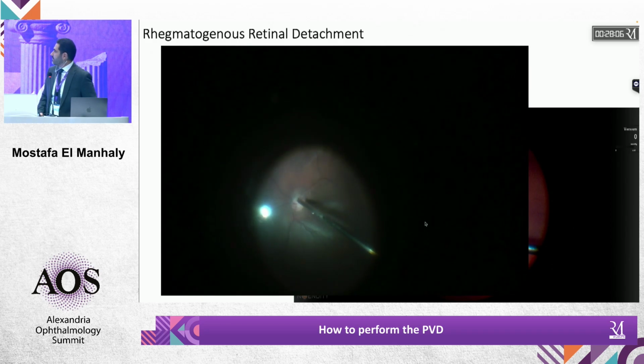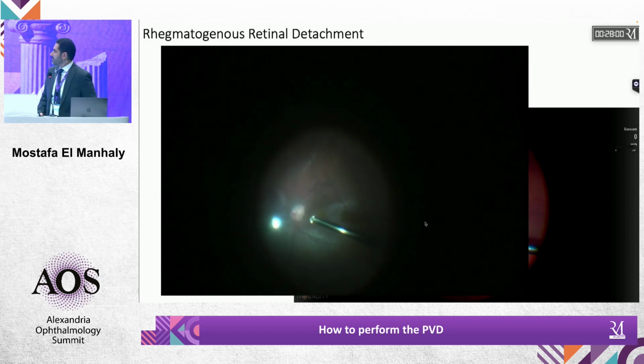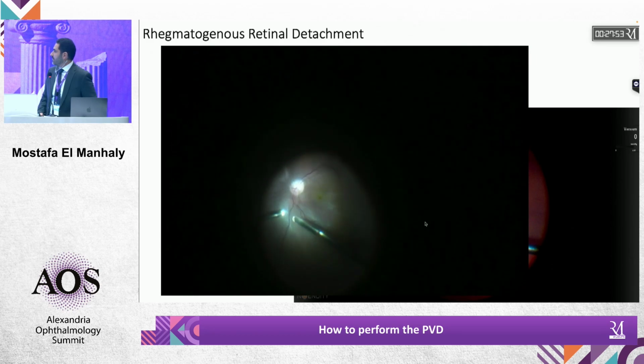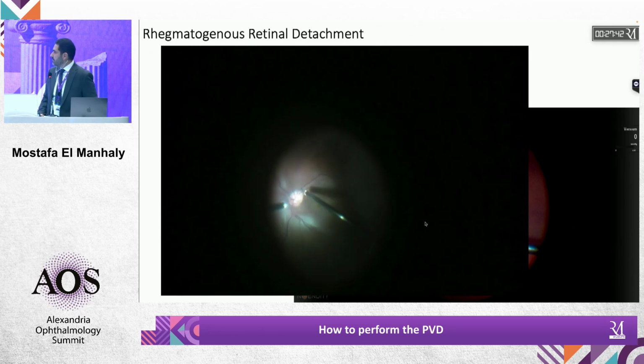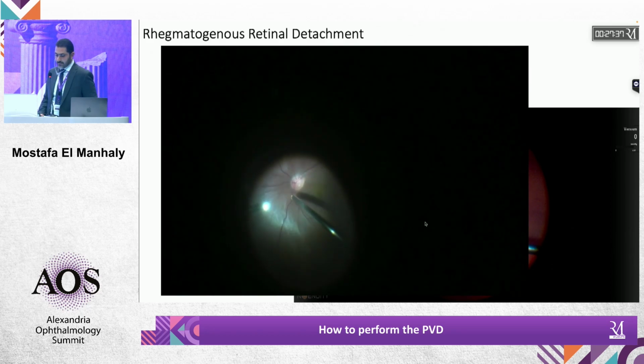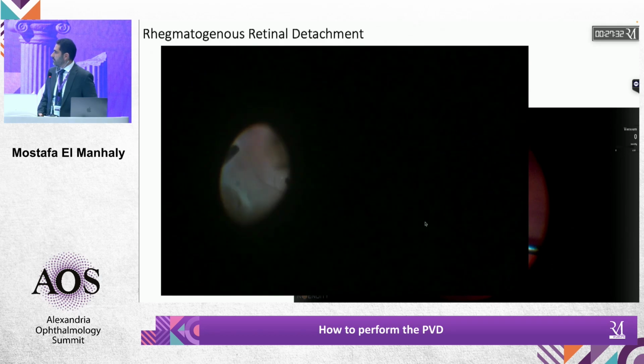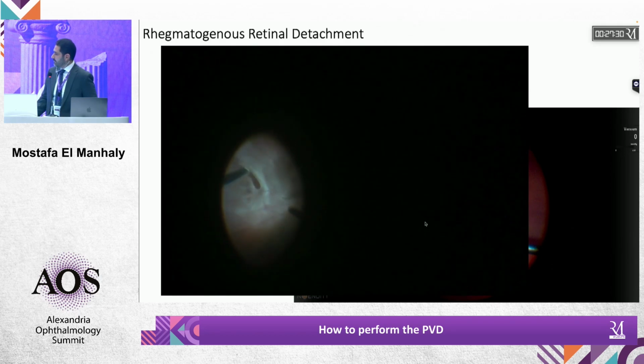Dr. Hassan. Yes, I think whether you are using the phaco-fragmentor, with which you should remove the vitreous as completely as possible, or you remove it with a probe, you have to remove the posterior hyaloid first, because you are creating traction. Yes, vacuum. And this vacuum, you cannot control it. Is it applied to the fragments or to the posterior hyaloid? And this traction can be transmitted to the retinal periphery, creating retinal break. So why not remove the vitreous completely before dealing with the fragments? Sure.